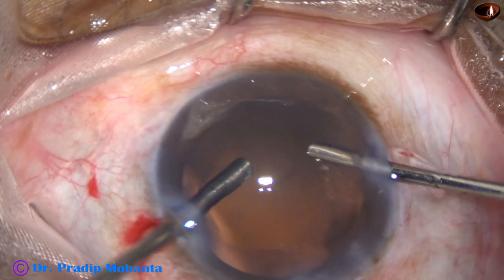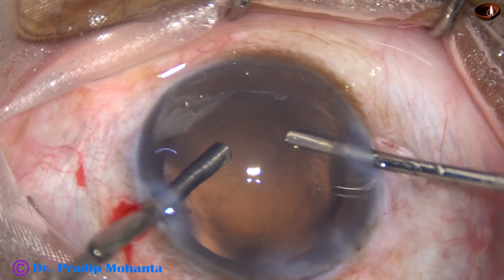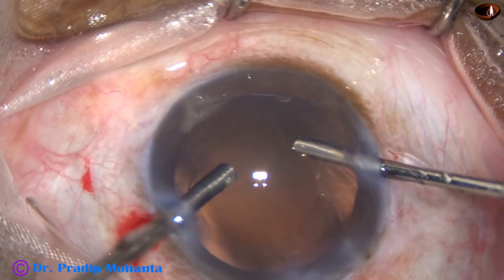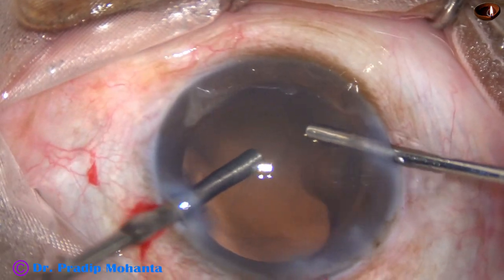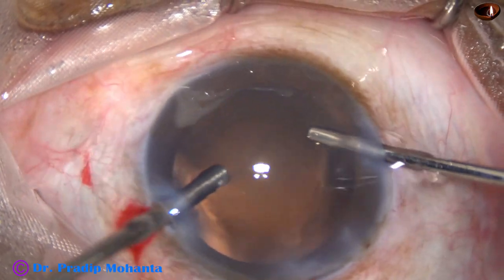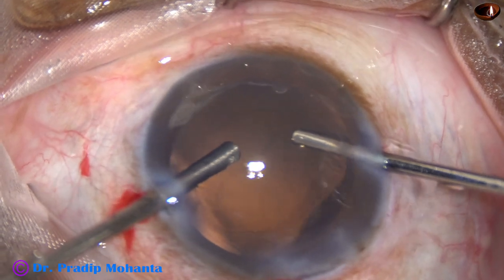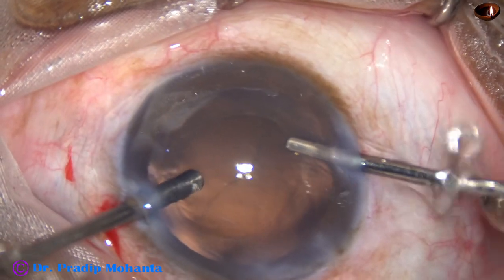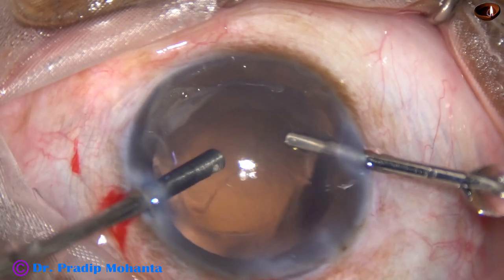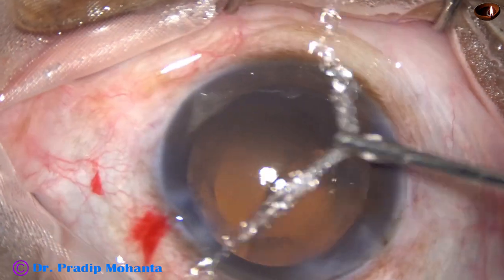Bottle height should be about 60 to 70 centimetres. Cutting rate is about 3000 — this is Faros from Oertly, Switzerland. A nice vitrectomy is done.